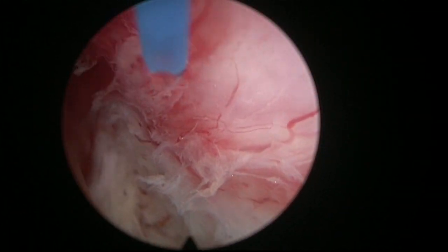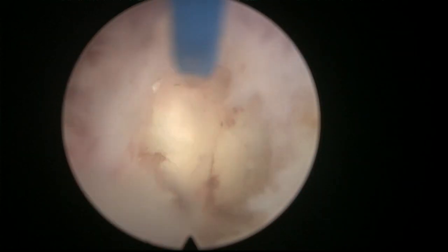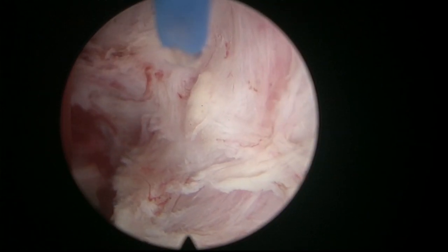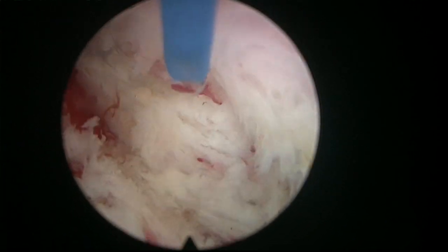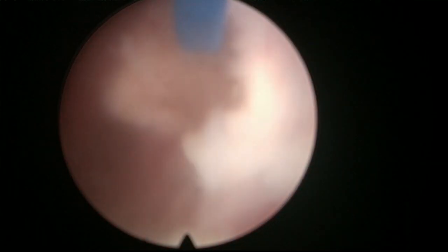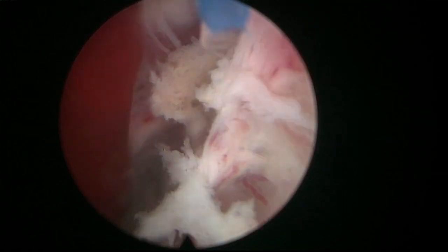And this is the mucosa of the sphincter, you see? So the next step is going to be to cut on the prostate to try to deepen the white line for 3-4 millimeters, 5 millimeters, something like that. I'm not trying to develop the plane, I'm just trying to cut the adherences of the apex to the sphincter. And then I'm going to try to look for the good plane.